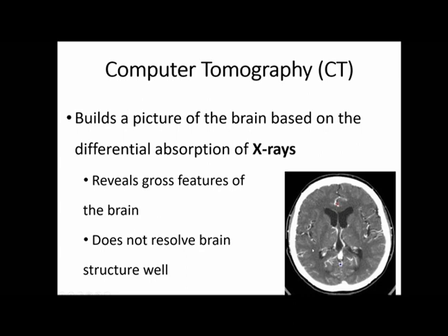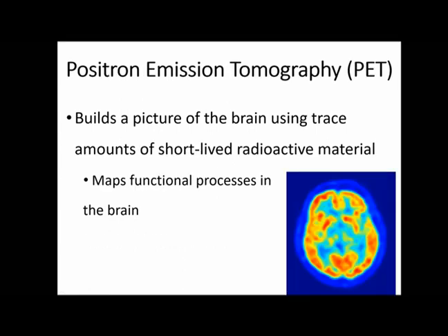And even looking here, it's not even going to give us a really good definition between, say, the different parts. We'll use the terminology later, but you can kind of tell the hemispheres apart if you know what you're looking for, but you're not seeing a difference between, say, the lobes or anything like that. So basically, it's giving us an overall broad look. You'd see if there was something wrong, say a brain bleed or a dense mass of foreign material like a tumor. That would show up on one of these scans, but that's kind of it.